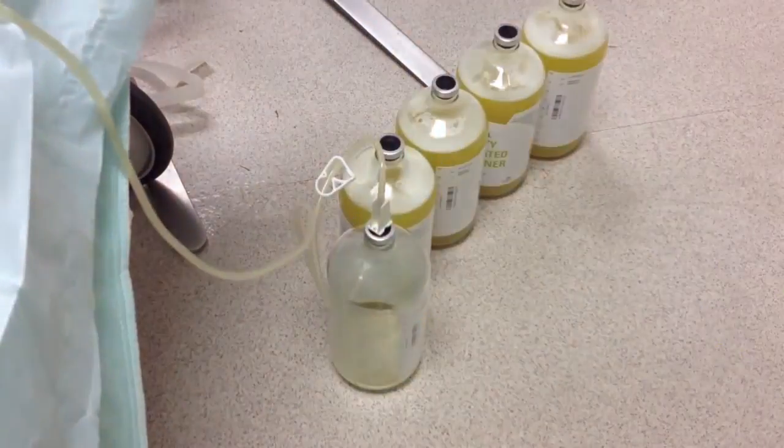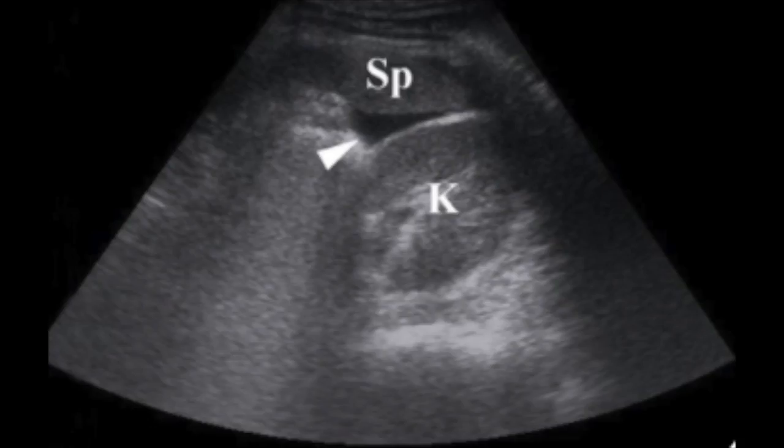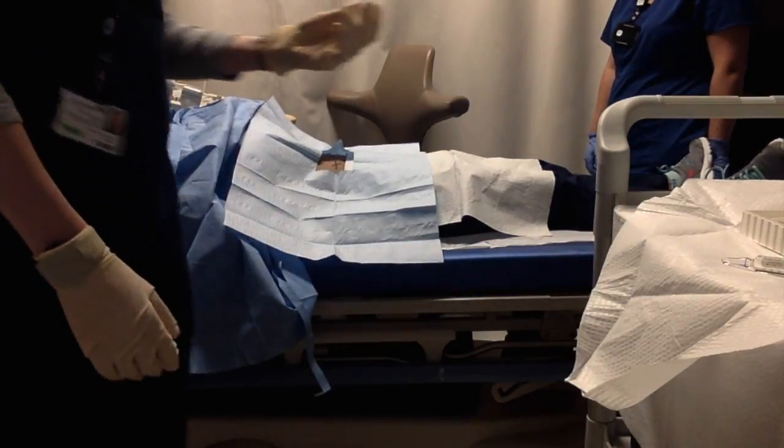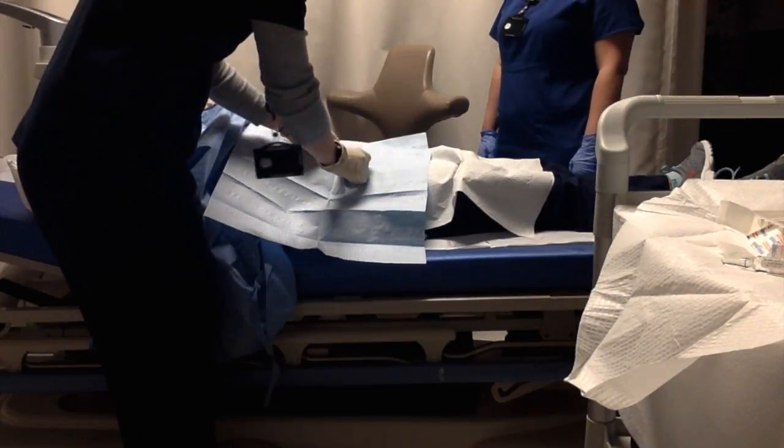Once the fluid stops draining, the radiologist will ask you to check the draining site to see if all of the fluid has been drained. Use a sterile probe cover to check the area. If all the fluid has been drained, the radiologist will remove the needle from the site.